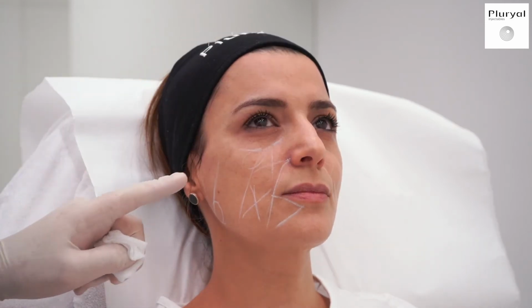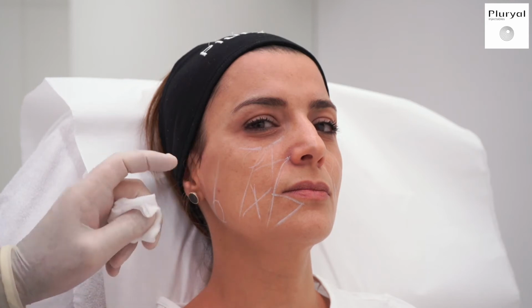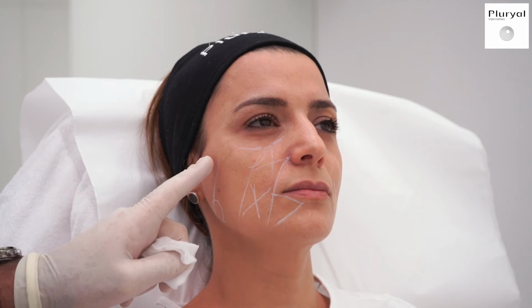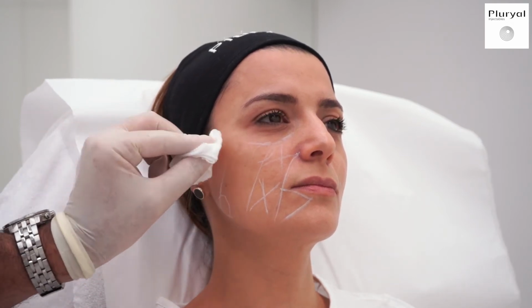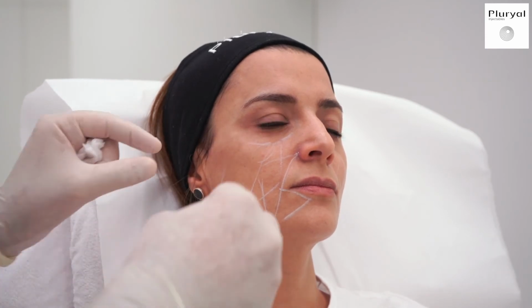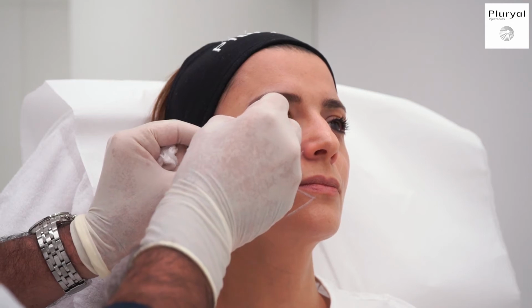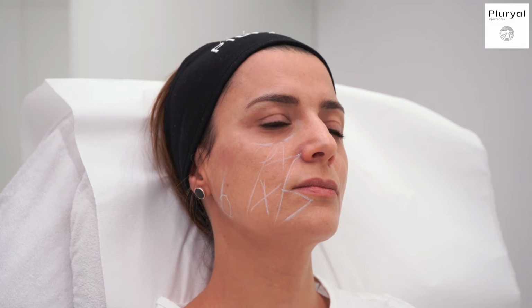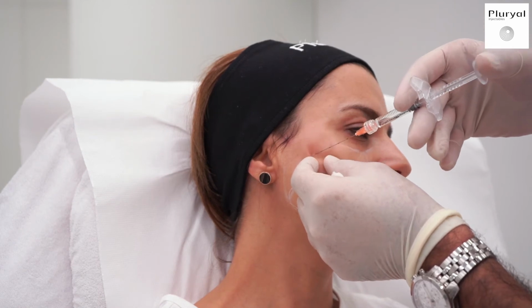Now that we have done the cheekbone area, now there will be a hollow in the pre-auricular area or premasseteric area. That's why we have also to fill this triangle. I will also be using here Pluryal volume lidocaine, and I will inject it superficially.